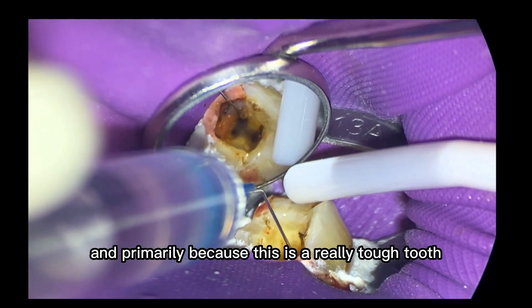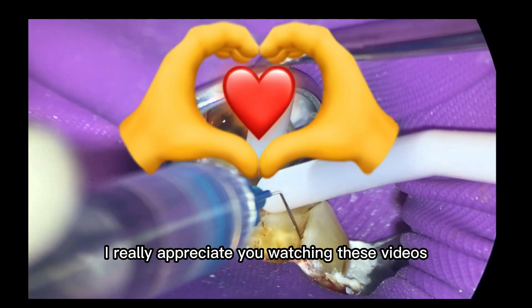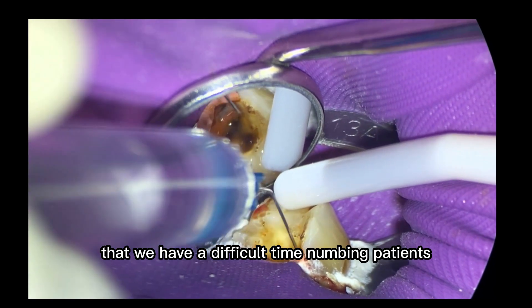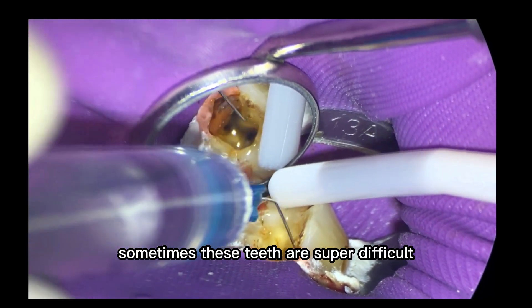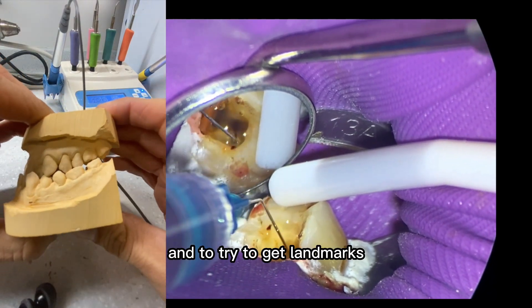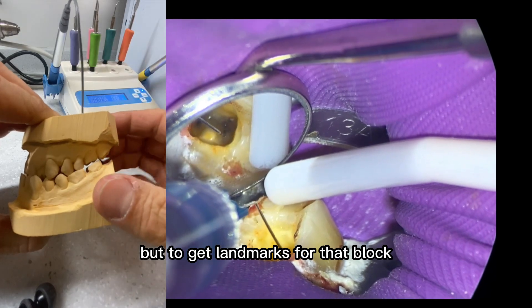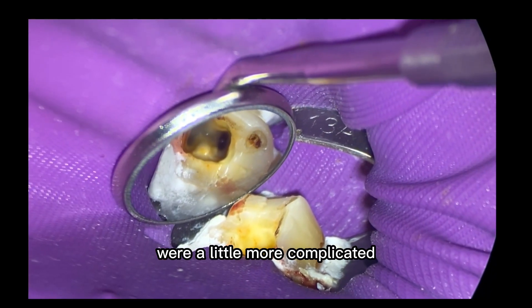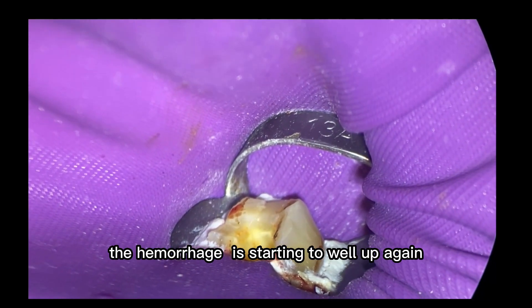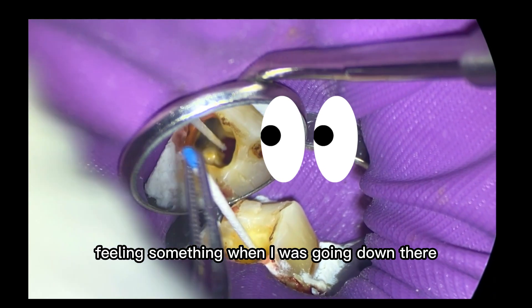Primarily because this is a really tough tooth to numb. If you're not a clinician and you're a patient, I really appreciate you watching these videos. Sometimes these teeth are super difficult. This patient is very interesting because he has what I would almost call a super class three, and to try to get landmarks for that block — I've been doing this for 25 years — it's a little more complicated. The hemorrhage is starting to well up again.